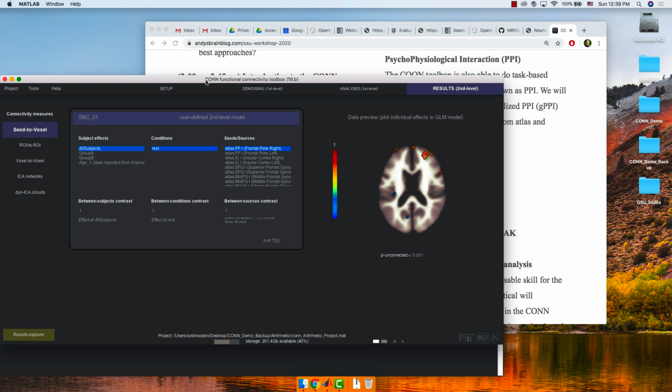We are entering the last phase of our two-day workshop, which is going to be focused specifically on scripting. We'll finish up with viewing the analyses. Scripting, how to import things like your custom atlas, doing a PPI analysis as well, and then we'll be reviewing some potential data sets for analyzing. We'll set up a template, and then I'll try to get the ball rolling. And after I leave, if we have some idea about what data set we want to analyze, I'll make a walkthrough for that, just to try to apply it to a different scenario.